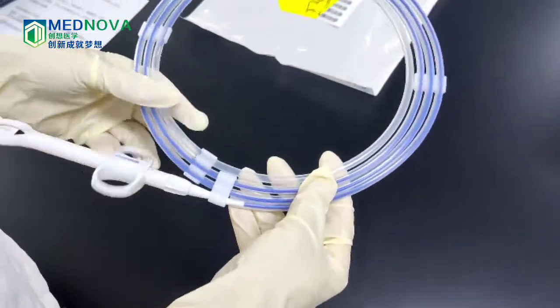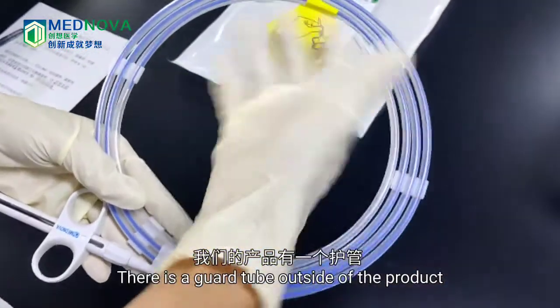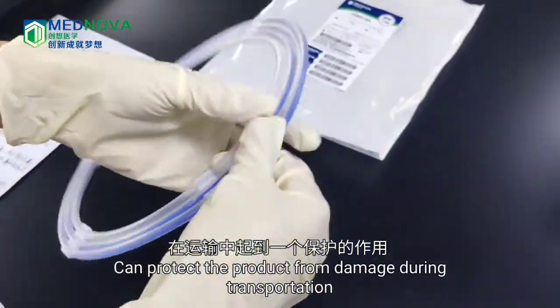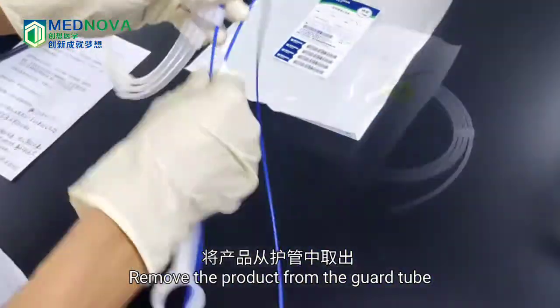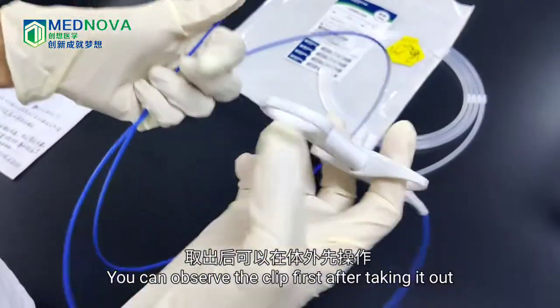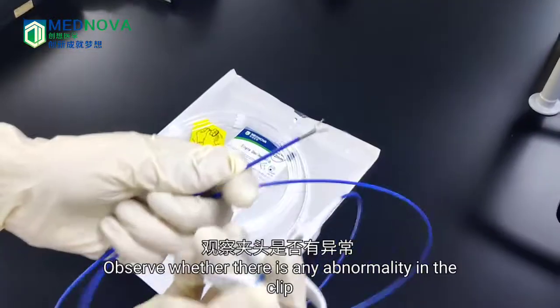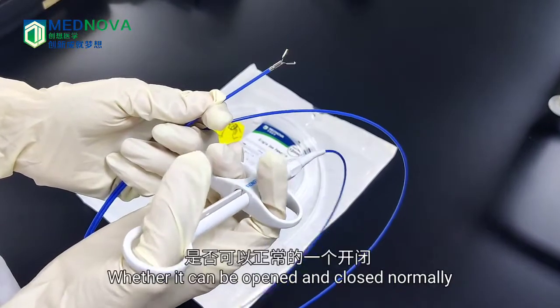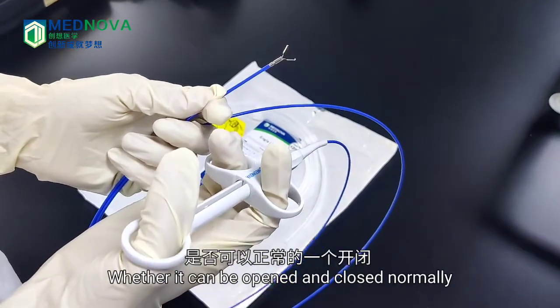This is a single-use hem clip. There is a guard tube outside of the product that can protect it from damage during transportation. Remove the product from the guard tube, and observe the clip after taking it out.